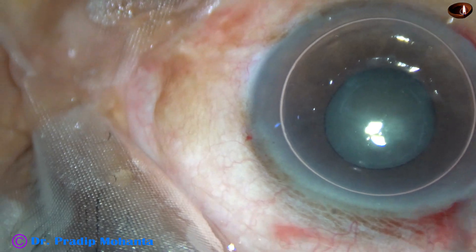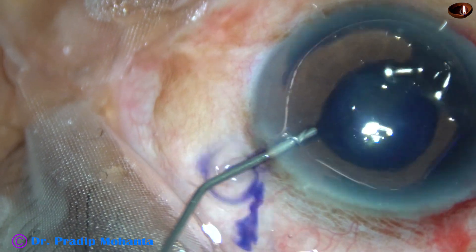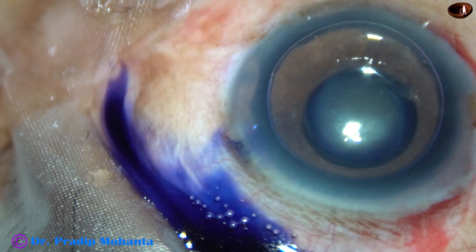After the main incision, the anterior capsule is being stained with trypan blue dye underneath an air bubble.